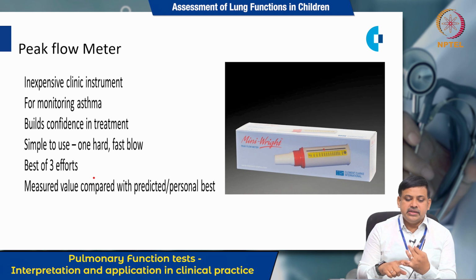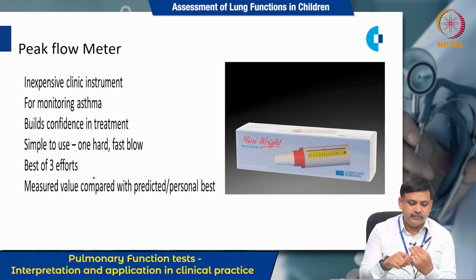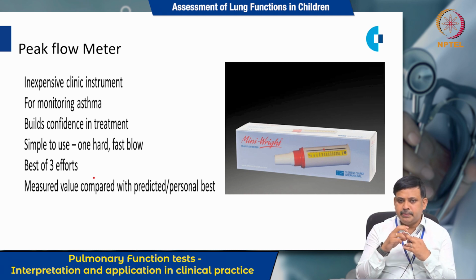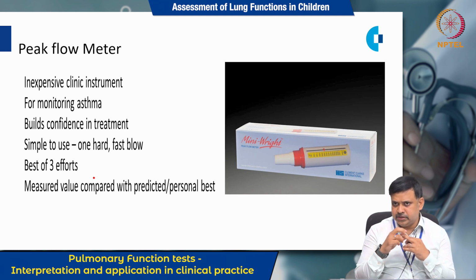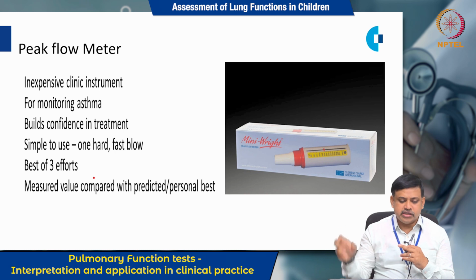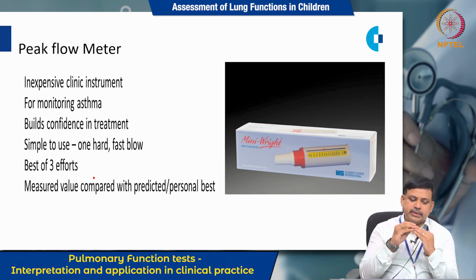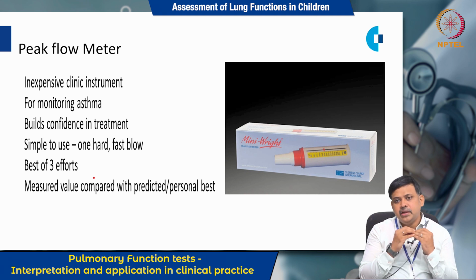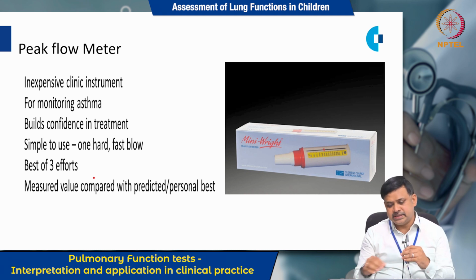The main thing is that it helps build confidence in the treatment. If the treatment is working very well, then it builds confidence. It is very simple to use. You just keep it in your mouth with a mouthpiece, and give one hard and fast blow. We have to take the best of 3 efforts. The measured value is compared with the personal or predicted best.